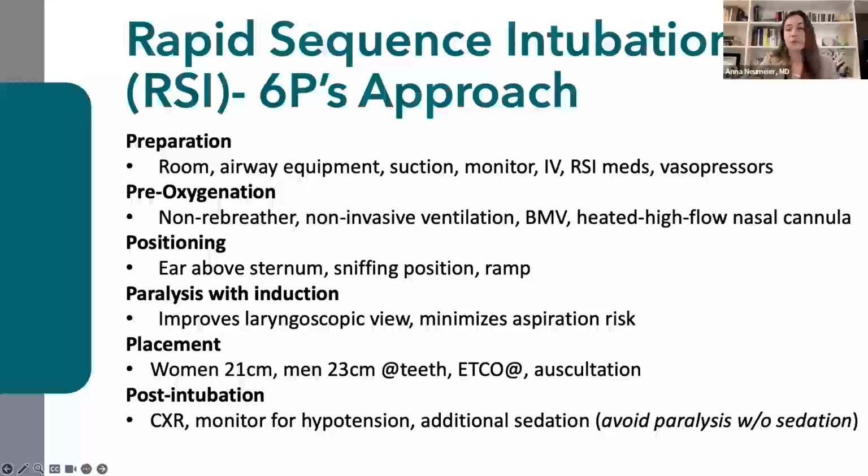By thinking through this 6 Ps approach as you plan for an intubation using RSI technique, you will be able to ensure that all steps are adequately followed, as well as identify potential complexities or difficulties to plan for and address ahead of time.